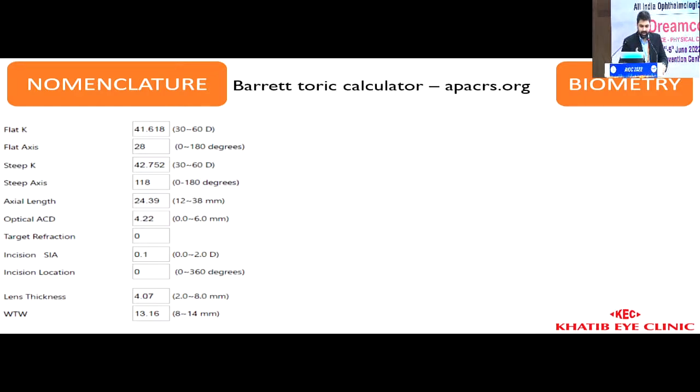You feed in whatever you get from your keratometry and axial lengths. Ideally, for starting your toric cases, again, if you want to be safe, an optical biometer would, according to me, be a better option than going for keratometry from an autoref and ultrasound, because the optical biometer gives you all the parameters that you can feed in.